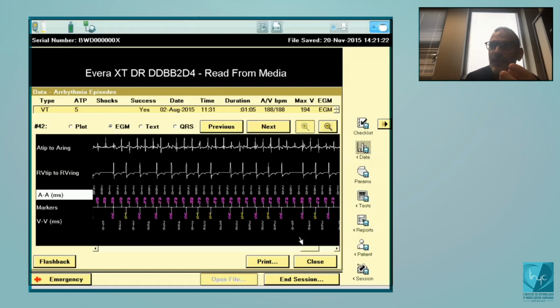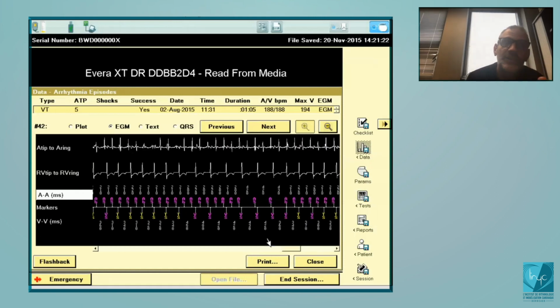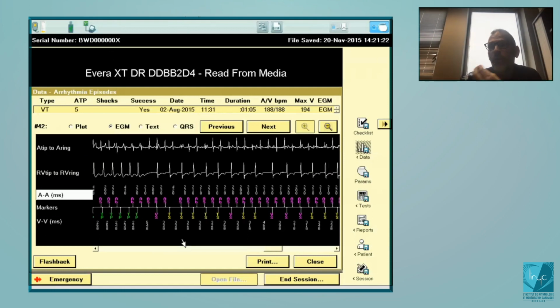Okay, and that's why when people say, okay, I implant dual chamber ICD just for the discrimination, see. In some patients, there is no indication for pacing, and therefore no indication for the atrial lead, except for the discrimination. Some people will say, okay, I consider that dual chamber discrimination is better than single one. I'm not so sure that's true. For example, here, what is better, the PR logic or the wavelet alone? At least if you program both, you need to understand in which specific situation there's going to be an analysis of the wavelet, because that's not going to be systematic.